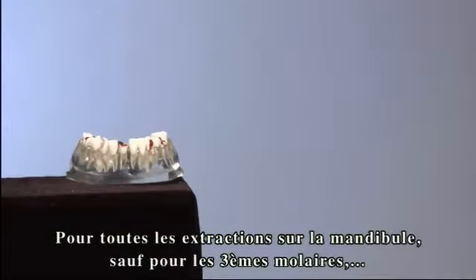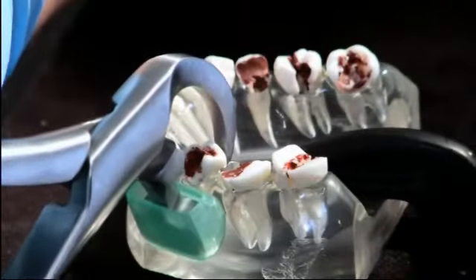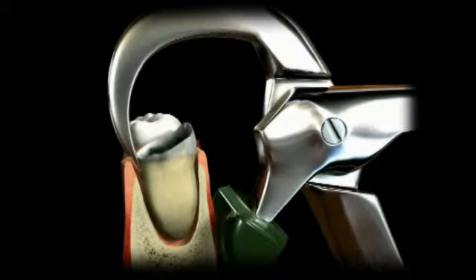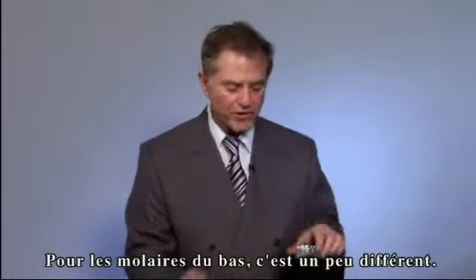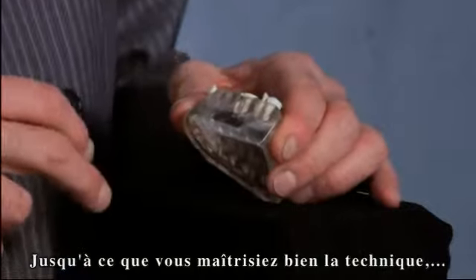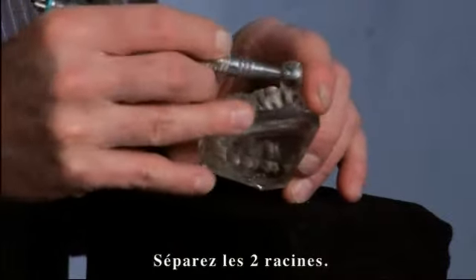On all lower extractions, with the exception of third molars, you will use the universal lower physics forcep. For lower molars it's a little different. If you look at the way the roots are made, these teeth are curved. Until you really understand the use of the lower physics forceps, we suggest that you take a surgical burr and cut the tooth in the middle, separating the two roots.